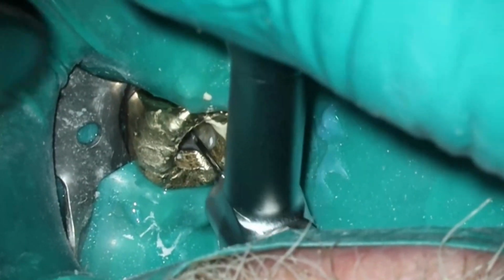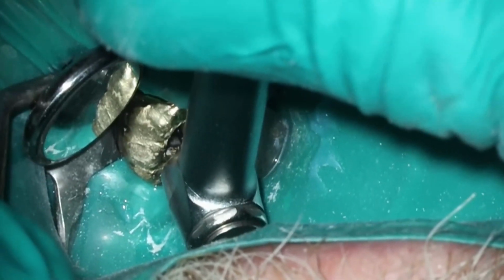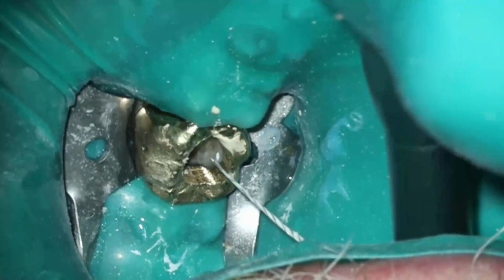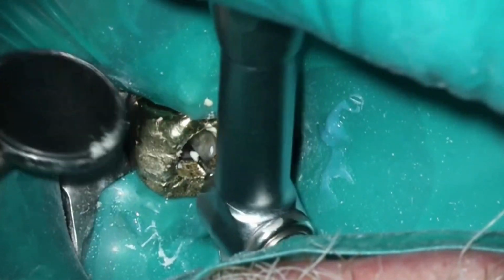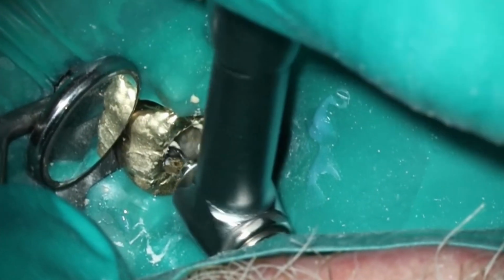But what I have found works really well is to actually take a rotary file back down. So the rotary file is removing some of the dentin, but it's also carrying the sealer down really nicely for me. And you can see I dropped both of those to 21, no problem there. And I'm not going to go back in and re-rinse or anything like that.